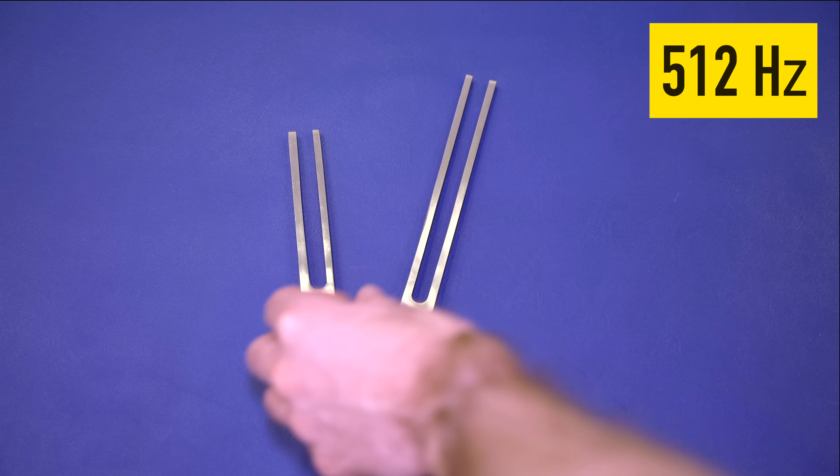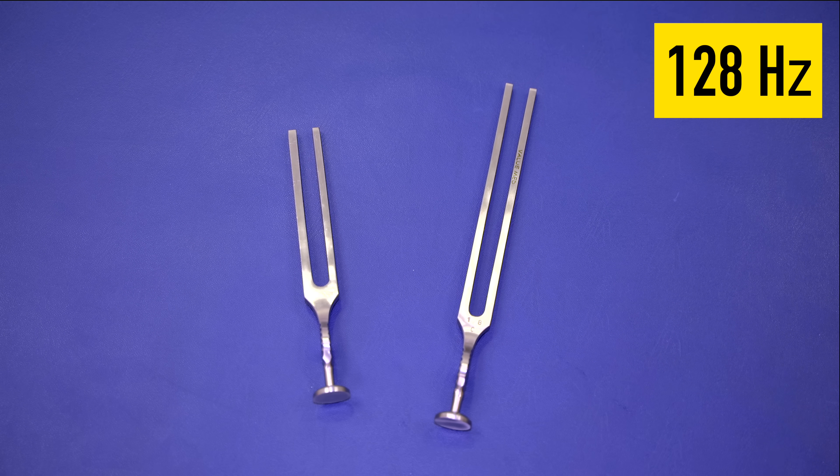There are two main tuning forks we're going to use. One is the 512 hertz fork, used for the Weber's and Rinne's test, because the vibration sound dissipates quickly, making it more effective for testing hearing. Then we have the larger 128 hertz tuning fork. The difference is in both amplitude and vibration frequency — the 128 hertz fork is much better for testing vibration sense, which relates to the dorsal columns.